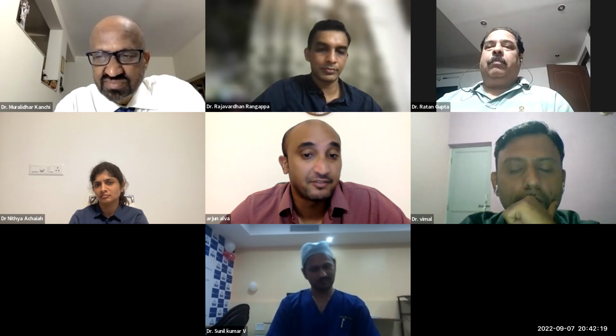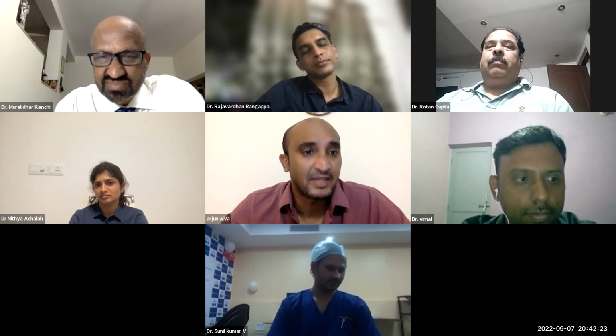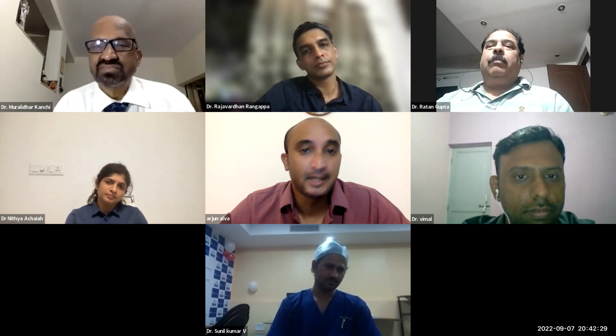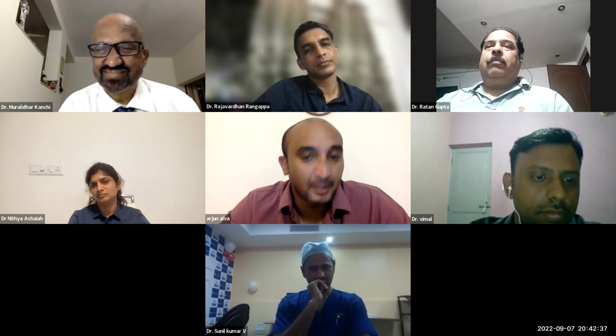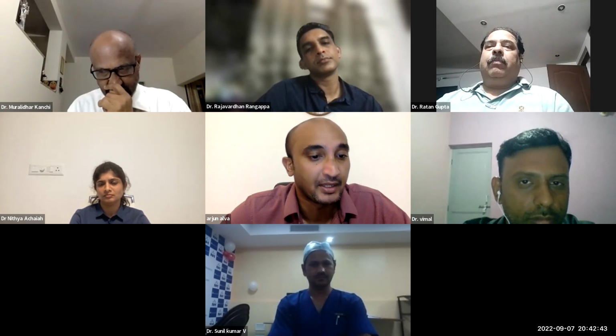Personally, I'm a big fan of bronchoscopic guided percutaneous tracheostomy. I think it's very safe, and the confirmation is much easier. As Nitya said, puncturing the posterior wall is also much less likely. So for me, bronchoscopic guided percutaneous tracheostomy is the safest percutaneous tracheostomy procedure. Yeah, thank you.